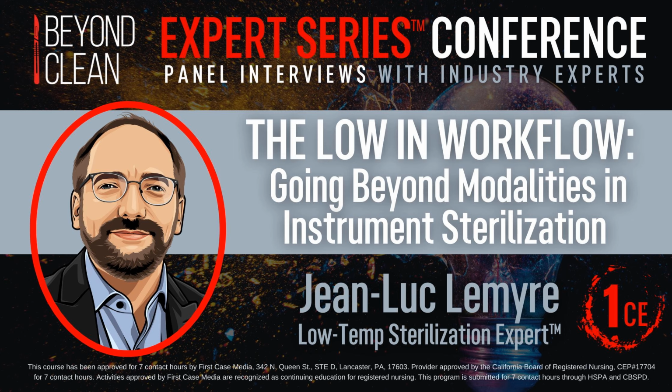Yeah. So tell us a little bit more about what the big deal is with water and a hydrogen peroxide sterilizer. We talked some about the cellulose products where you don't want to put paper or sawdust in there, but why is water such a big deal, and why are the machines aborting because of the water? What are the hazards with it?